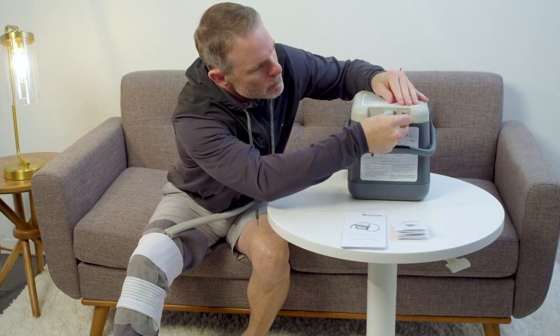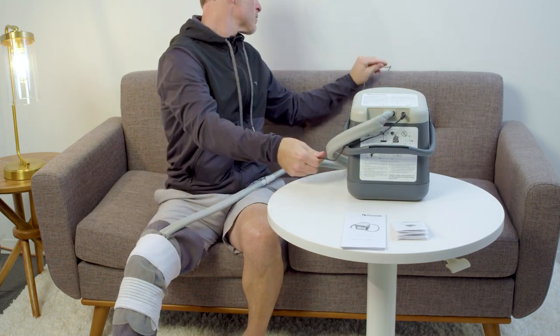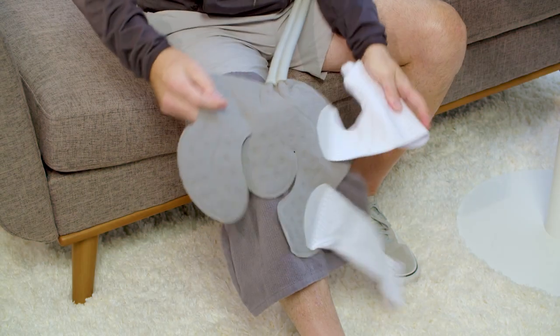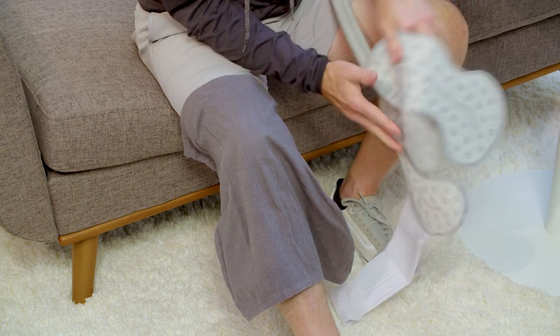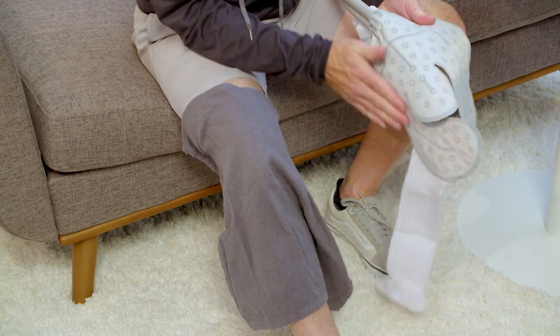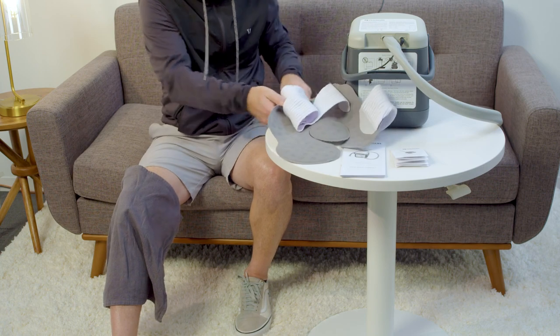Ensure that the power supply connector is properly inserted into the port on the unit and that the wall plug has power. Visually inspect the pad to see if water is flowing. If water is flowing, check the pad for pockets of trapped air. Gently massage the pad to help remove the trapped air. Once water flow appears to move freely through the pad, resume usage.